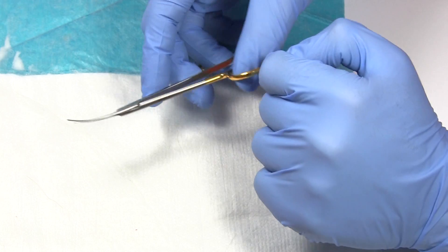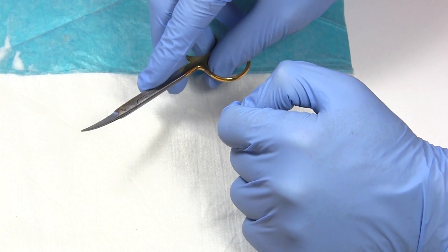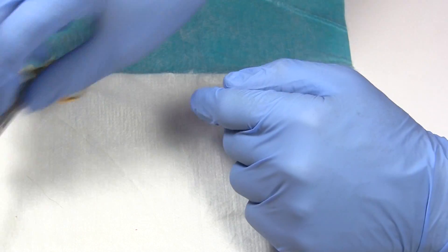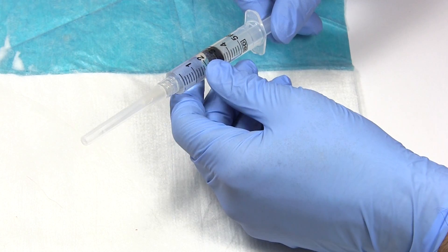A pair of scissors — some iris scissors. These happen to be curved; they're good for getting in and trimming tissue, something you don't really need a scalpel for. Also good for trimming the suture — plenty of uses for those.